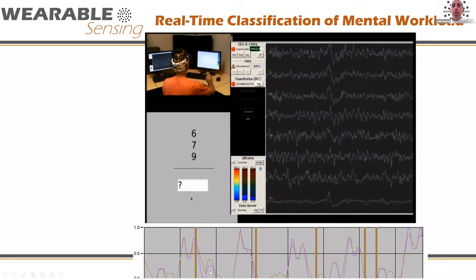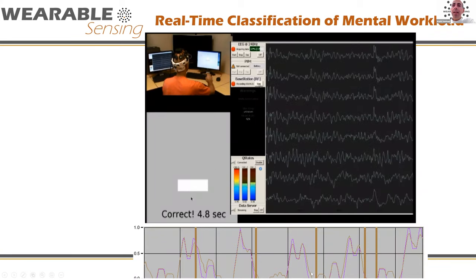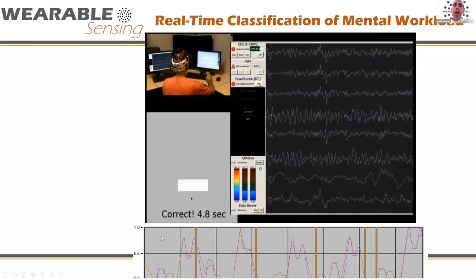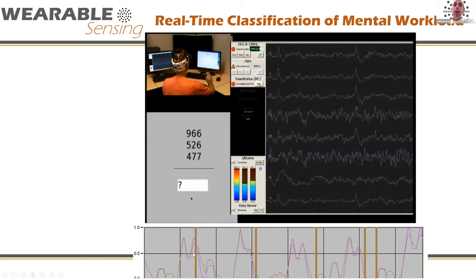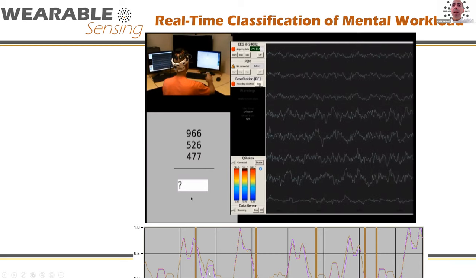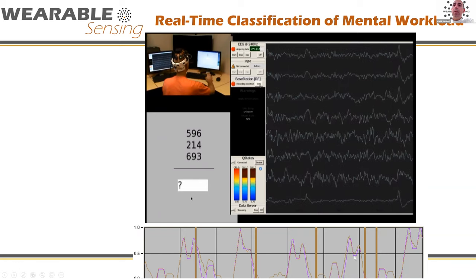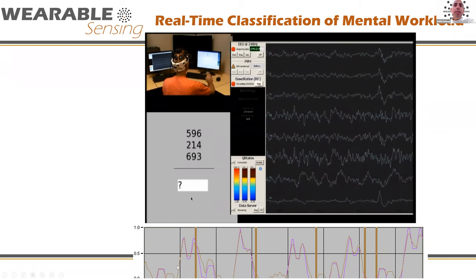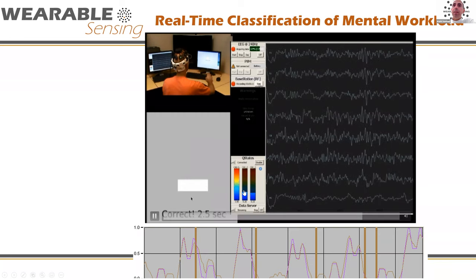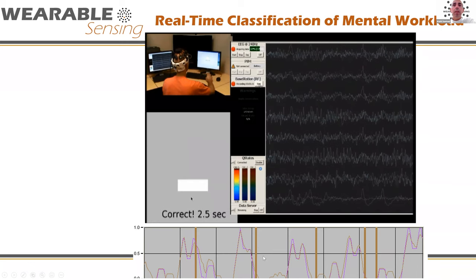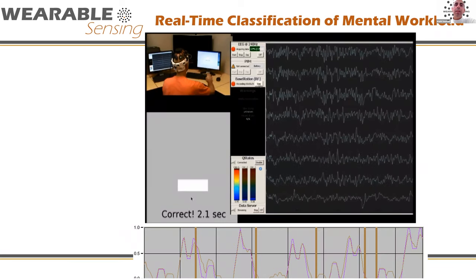We can also look at this as a time course and analyze the data afterwards. The x-axis is time, the y-axis is the output of the mental workload gauges. The first three bumps were easy math problems, followed by two hard problems where workloads went higher, then three easy ones — and you can see they're not all equally easy. Then two hard, three easy, two hard, three easy, two hard, three easy. We can really track how hard the task is by looking at the EEG-based output derived by Q-State.